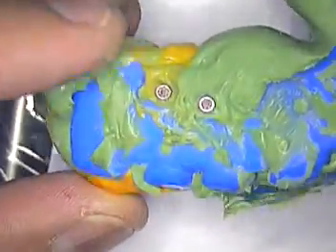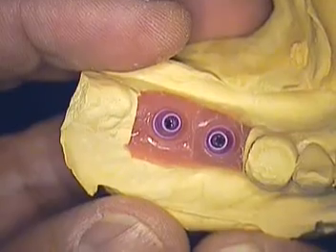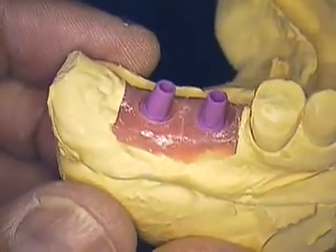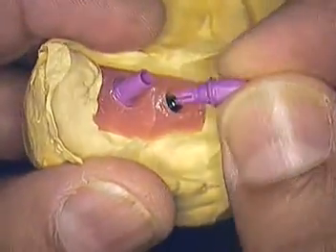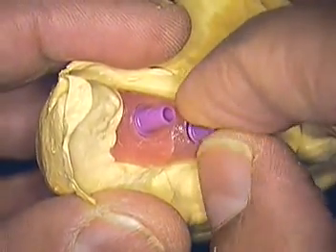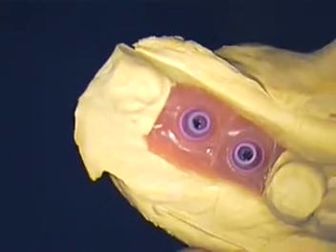What you're looking at right now is an open tray, and we'll ask the lab to go ahead and pour these up. The first model is already poured, and what we have done in this particular case is placed the plastic crossfit — RC crossfit plastic. These will actually mimic the abutments that Strauman sells online.